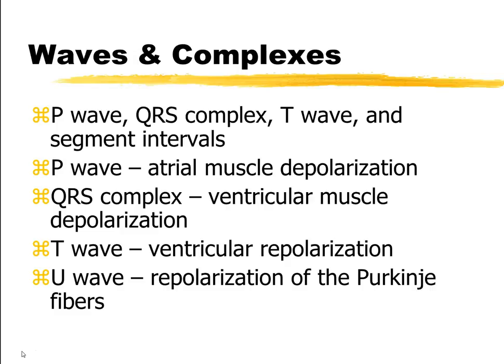And sometimes you're going to see a little U wave hanging out there at the end of the T wave, and that's the repolarization of the Purkinje fibers. It's not always there, only under special circumstances.